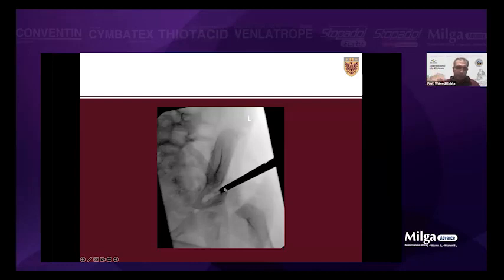So I use the intraoperative measuring tape. It comes in our drapes anyway. So I have white paper tape, so we can use it intraoperatively. You hold it with a mosquito. Then I measure the graft and mark it with the saw, and then I do my V-cut. I like the vertical one because over time it doesn't cause deformity, and it's going to be filled with bone.